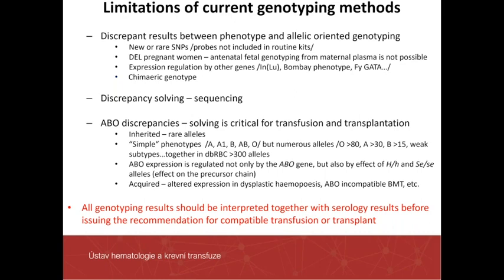And also we are limited when expression of a specific gene is regulated by other genes, like in the Lutheran null phenotype in the Lu system, also the Bombay phenotype in ABO or the Duffy null phenotype, where the GATA mutation is present. And also we can have atypical results and complicated interpretation in the case of chimeric individuals.